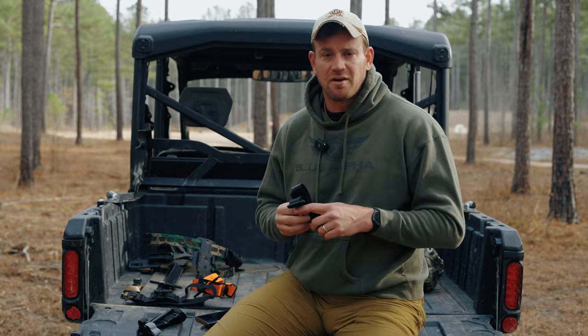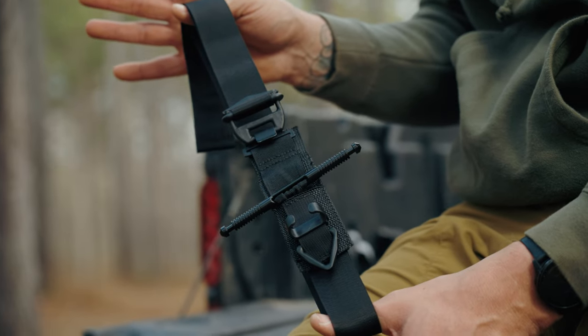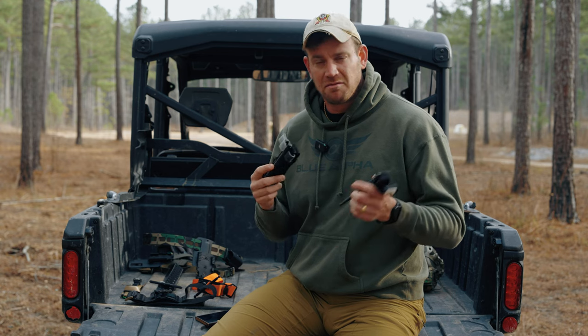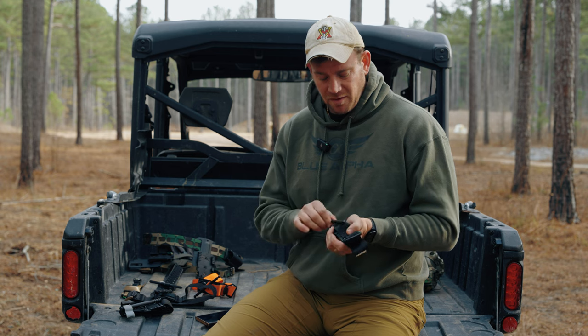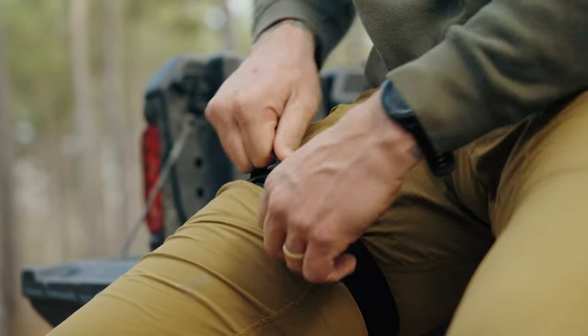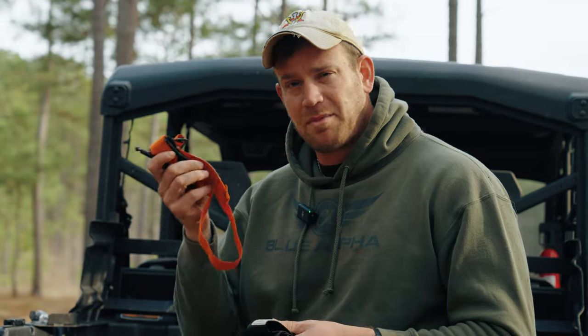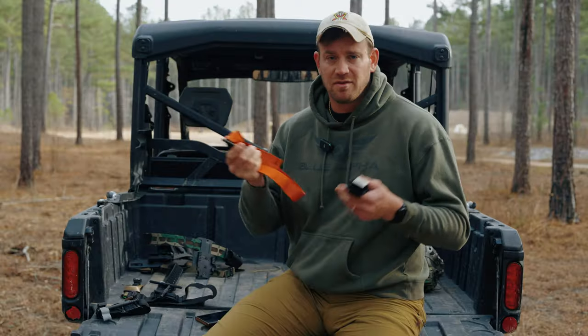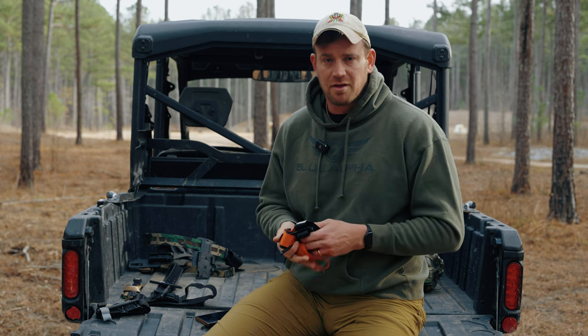Next is the Soft T Tourniquet — it's probably the second most popular. It's been adopted by a lot of units in the military. I think what made the Soft T popular in the beginning is that the windlass on some of the older CATs was a little flimsy, so people preferred the aluminum one. But the Soft T is still a really good option. It comes in a variety of colors — more color options than the CAT, if that's something you're looking for.